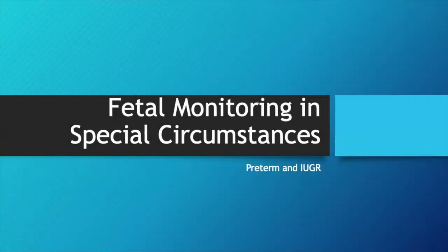We're carrying on with the special circumstances for babies and how to monitor babies in different circumstances. We talked in the previous sessions about meconium, chorioamnionitis and sepsis. Today we're going to be talking about preterm and growth restriction.